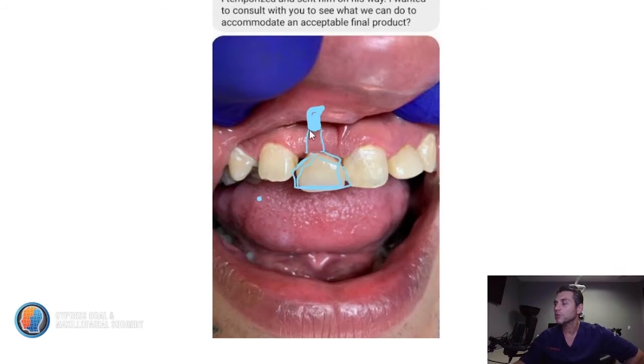It just was terrible. And so ideally what you want is you want the crown to look like this, smooth and kind of flow out like that. So, first of all, I would have temporized this patient. That's number one. But number two, how do you relay to the laboratory how you want the abutment to look, especially the part that goes under the gingiva? And how do you relay the gingival contours to the laboratory? And I'll show you how to do that.